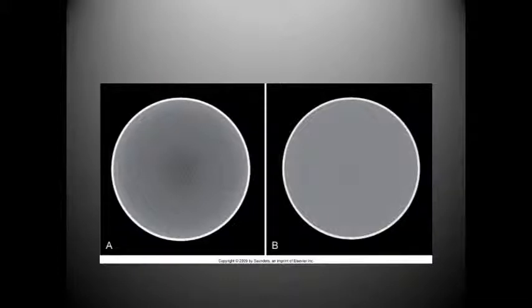Higher energy photons make it through and cause artifacts like this in the center. And that's because these photons come out of the patient at such a higher energy, whereas usually on the periphery they are scattered or deflected. And so to correct this, we have beam hardening algorithms which help to remove that, and we have an image like this.